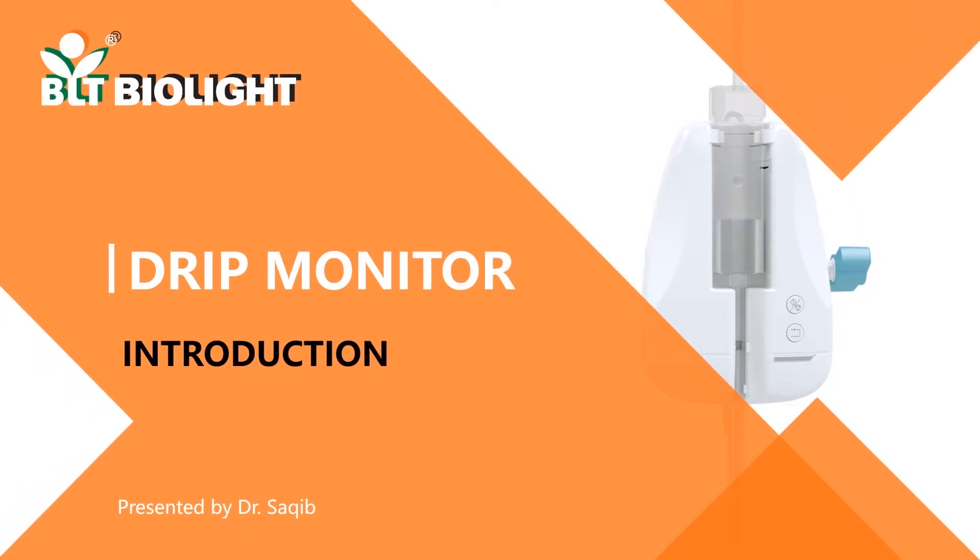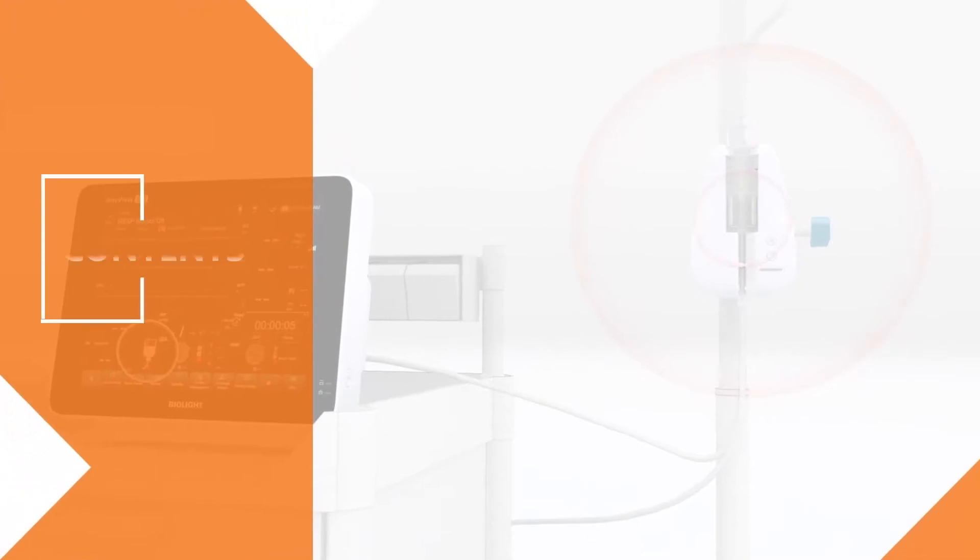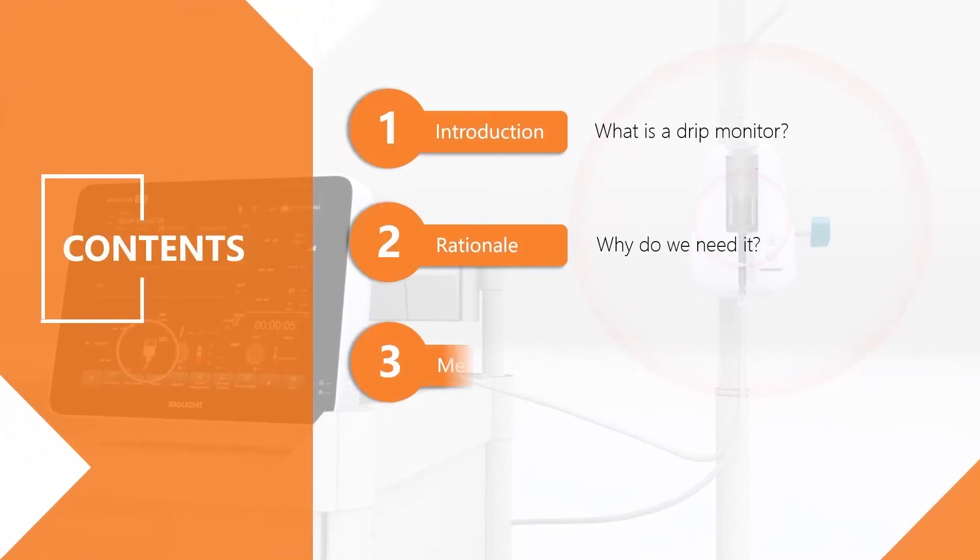Thank you for using BioLite. In this video, we are going to talk about a drip monitor — what it is, why we need it, and how to use it.